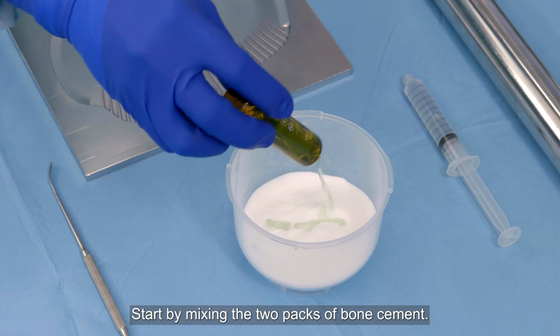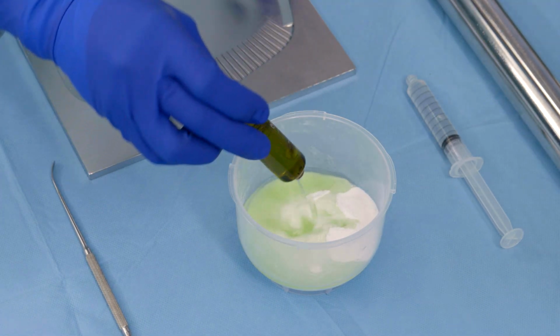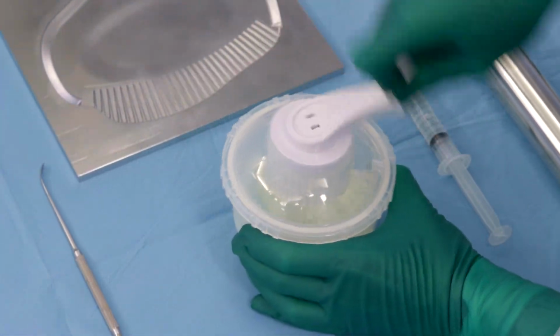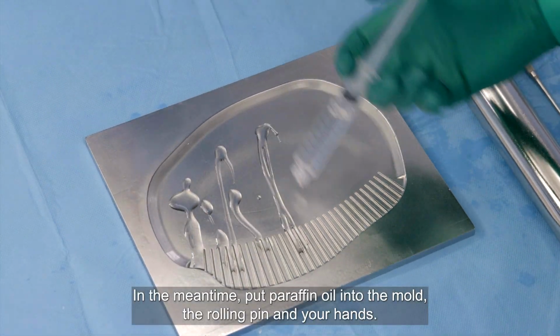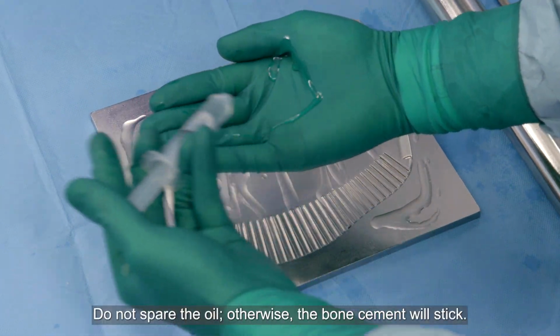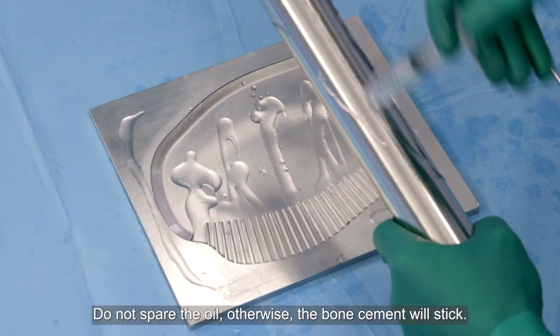Start by mixing the 2 packs of bone cement. In the meantime, put paraffin oil into the mold, the rolling pin and your hands. Do not spare the oil, otherwise the bone cement will stick.